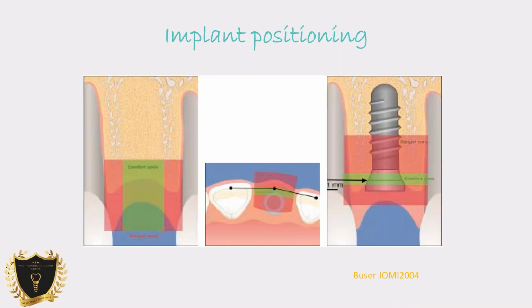If you're talking about an anterior implant, again, Boozer mentioned comfort and non-comfort zones. You need to make sure you're placing an implant from the adjacent CEJ at a distance where it's not too much submerged or too much coronally placed. In an anterior, you are looking at an access hole coming from the lingual, in my mind. Just think about where the access hole should be for a root canal. That's where you want your implant to come out. Ideally, that's what you need to look for, and that's how you need to design it.